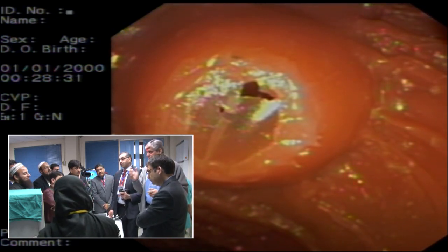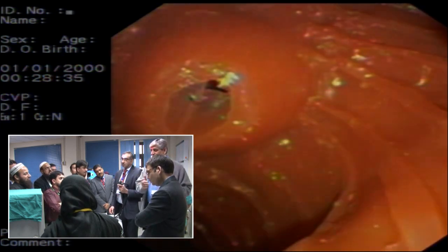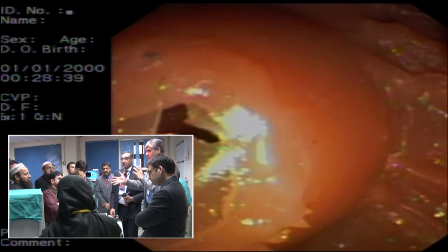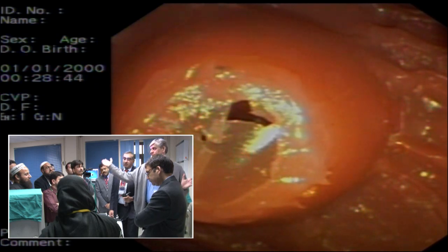So what you need to understand is these movements in ERCP are very, very important. This will completely change everything. This is a dummy. It will only give you a conceptual idea. But in real-life patients, if Wakar moves like this, the ampulla will move. See? And so that is what happens. When we give you the scope, the orientation has changed and you're wondering what the hell, he had such a good position.